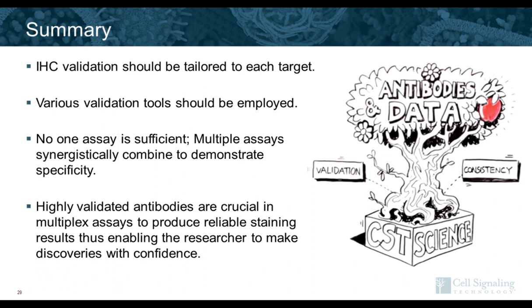And in an assay that's as complex as a 7 or 8 color OPAL kit staining, what we want to focus on is antibody consistency. So for that reason, we don't recommend using polyclonal antibodies. However, if it's the only option available, then it's something that can be considered.